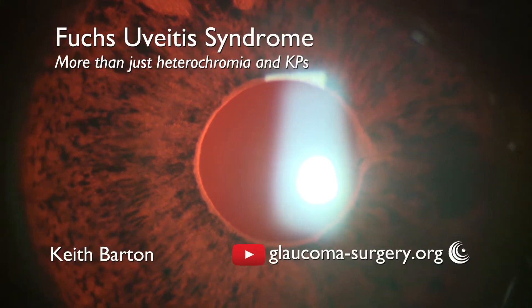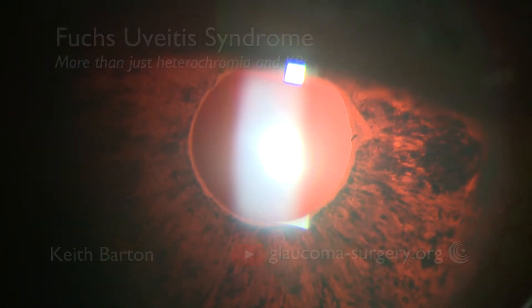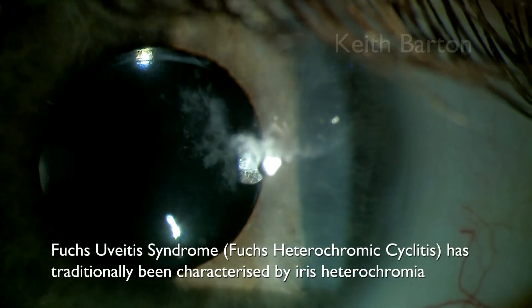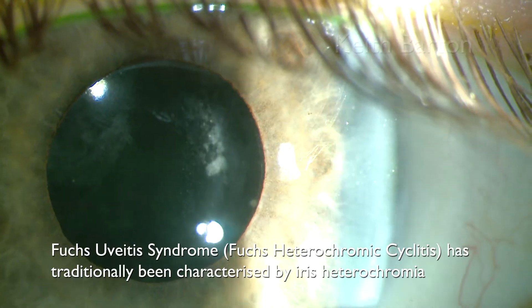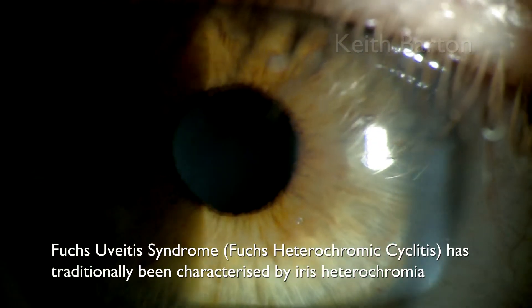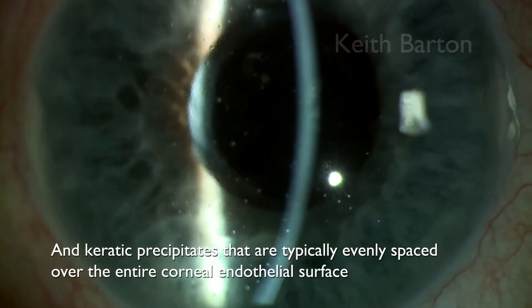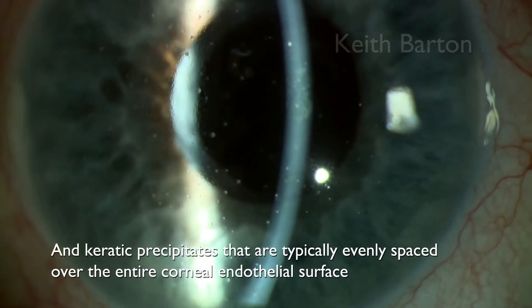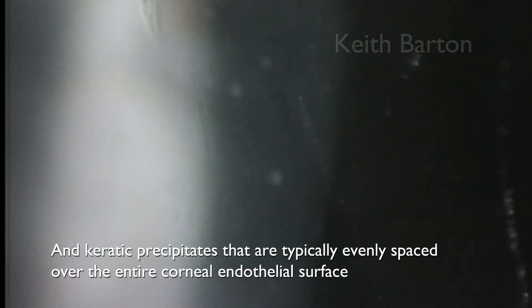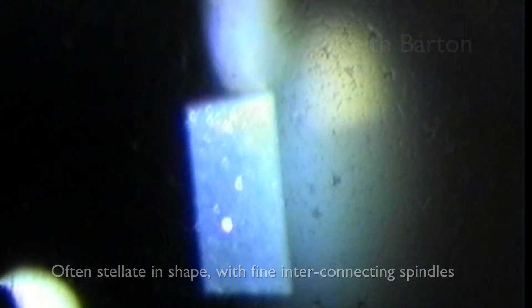Fuchs' uveitis syndrome, or Fuchs' heterochromic cyclitis, has traditionally been characterised by iris heterochromia and keratic precipitates that are typically evenly spaced over the entire corneal endothelial surface, often stellate in shape with fine interconnecting spindles, as can be seen here.